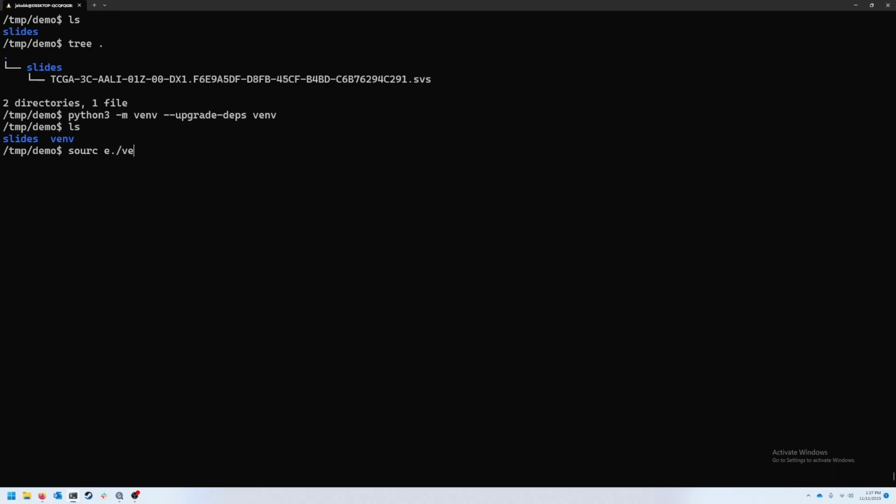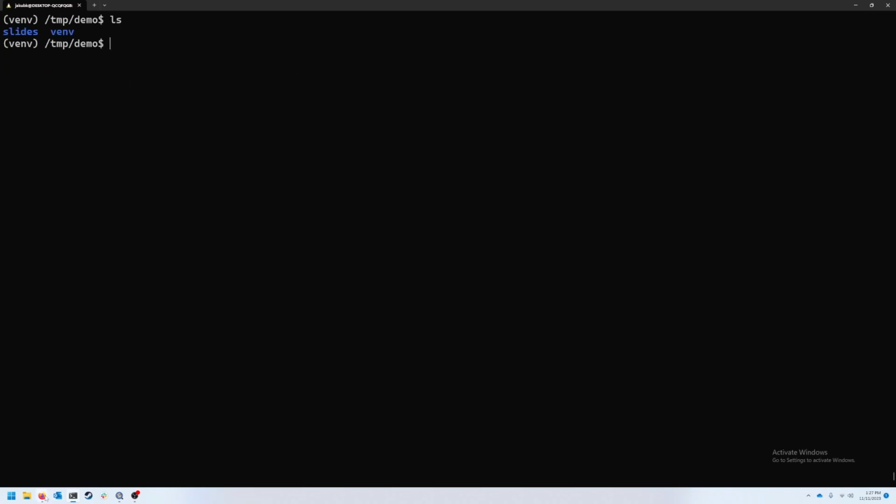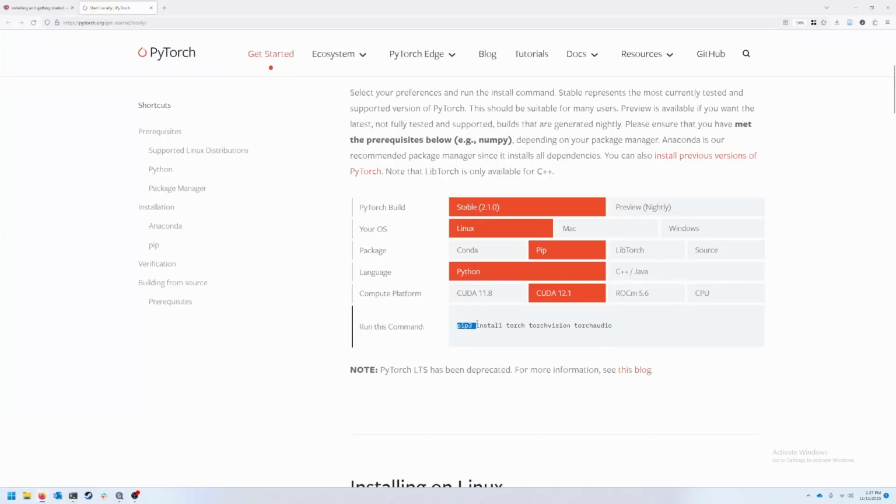Great. So now let's, excuse me, we activate it. And let's just double check that we're using the right Python. Perfect. So now let's copy this installation command.